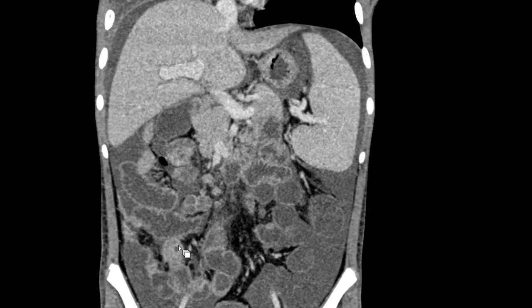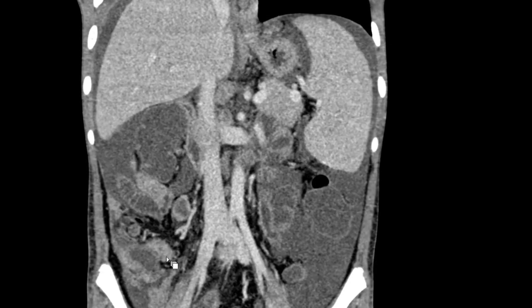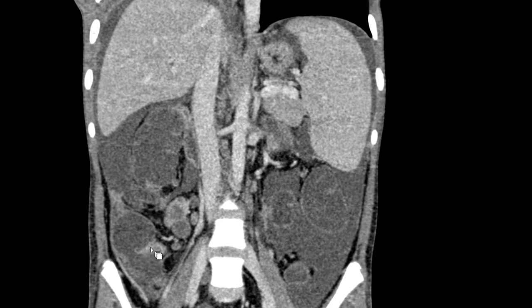So this was the ileum which is thickened. You can compare the other bowel loops which have thin walls, but this is the terminal ileum, which has thickened bowel loops, and when we trace it, it is going upward, and yes, it has opened into the ileocaecal junction. Normally the ileocaecal junction should lie at the level of iliac crest. Yeah, it is almost at that level.